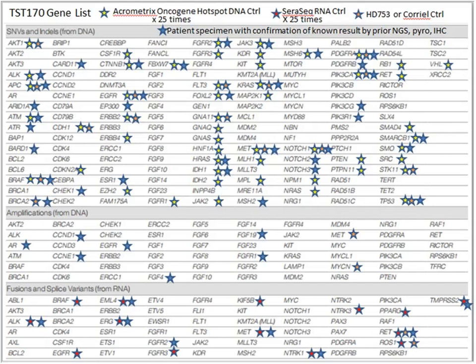which I think will be a greater need as well, greater demand coming from the immunotherapeutic services, as we now see indications based on microsatellite instability across tumor sites. So we're really expecting a dramatic increase in demand for these types of assays in the near future.